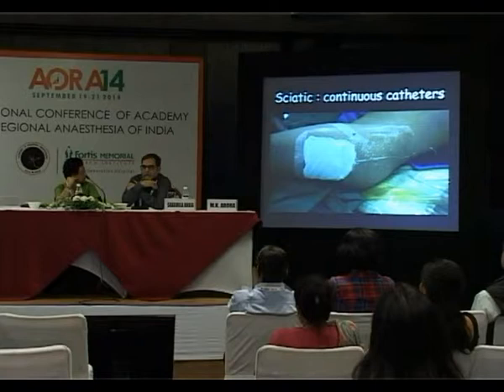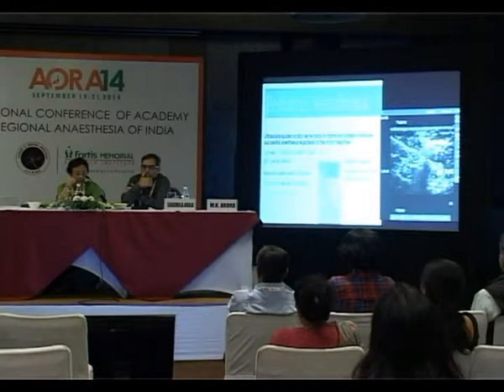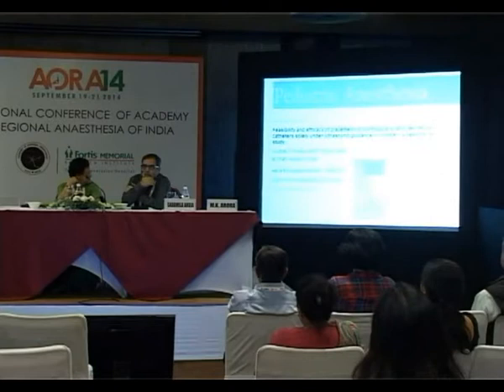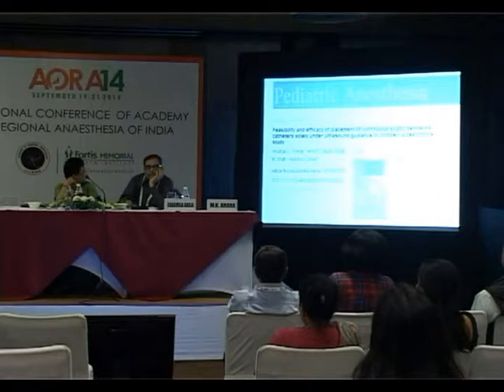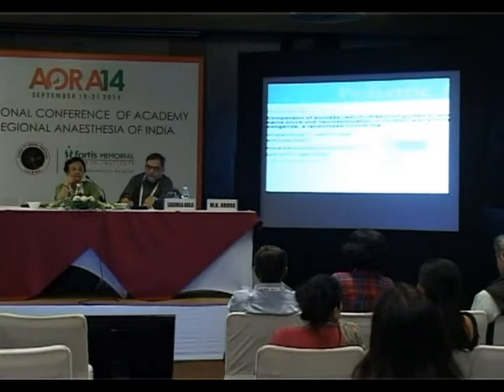fact. So the sciatic catheters, yes, pick up a probe and you don't need anything else other than a simple 2-inch needle and the catheter walking through it to work. So this is absolutely feasible. This is beautifully done. Yes, those people, the orthopedic surgeons might love to put a tourniquet, supplement it with a femoral block. They are going to tie a nice, maybe post-op plaster around your catheter. Let them go ahead. In fact, it fixes your catheter even better. After 3 days, go and pull out the catheter yourself or send somebody from your own team.